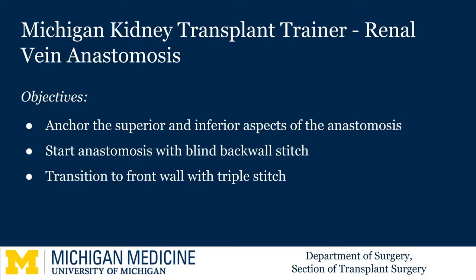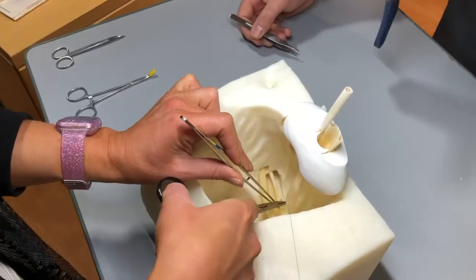Today we're going to be using the Michigan Kidney Transplant Trainer in order to practice the renal vein anastomosis during the kidney transplant.